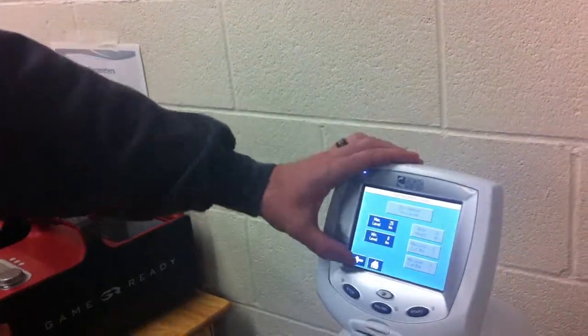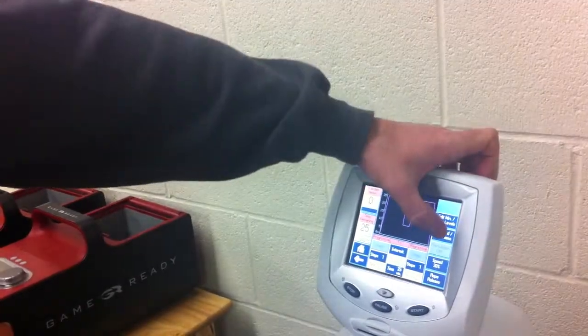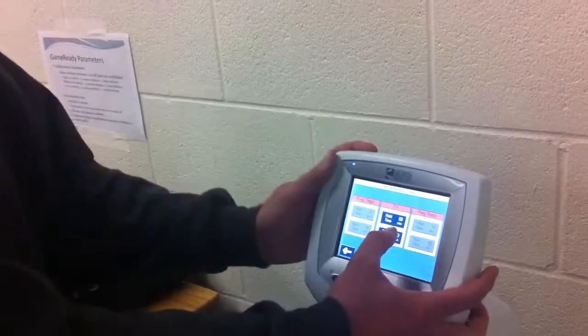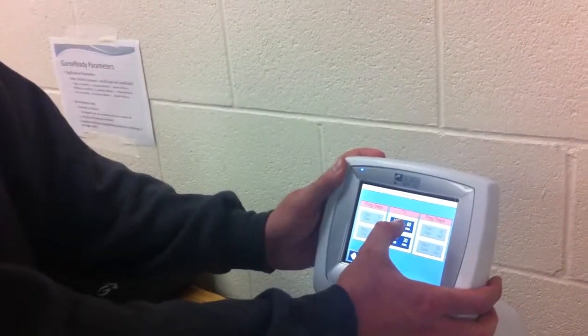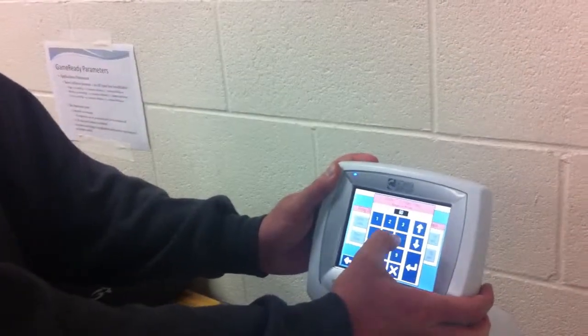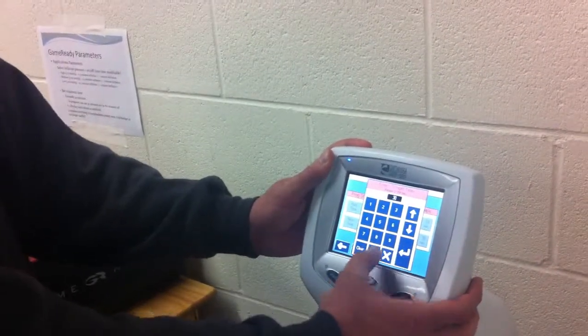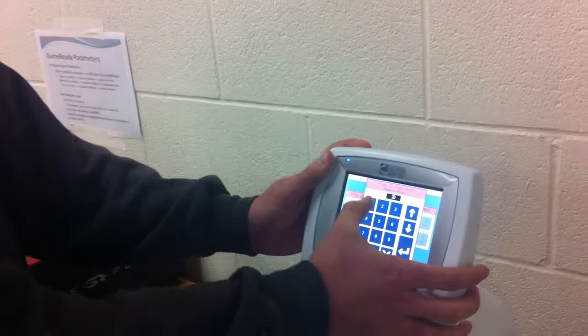Once you've got that, you can come back to the home or back to the next page, and then you can hit your treatment time. That also wants to be a 3-to-1 ratio, so we've got it 60-to-20, or we can go 30-to-10.